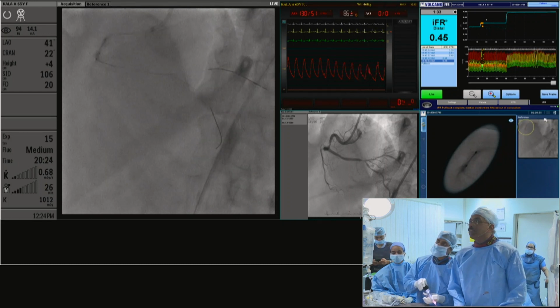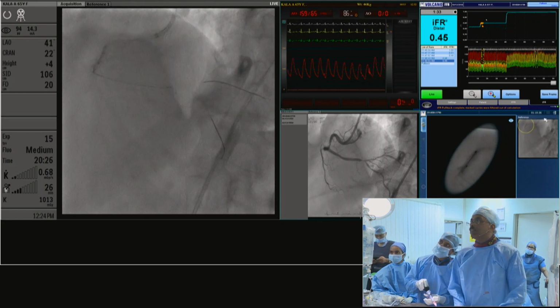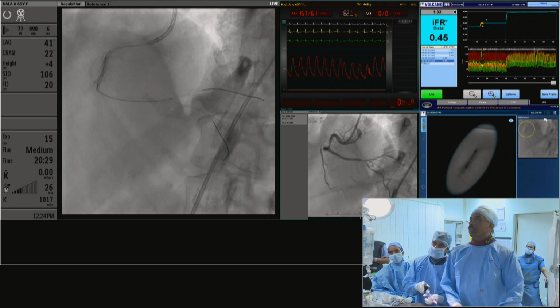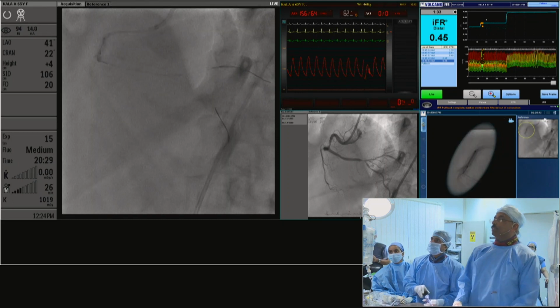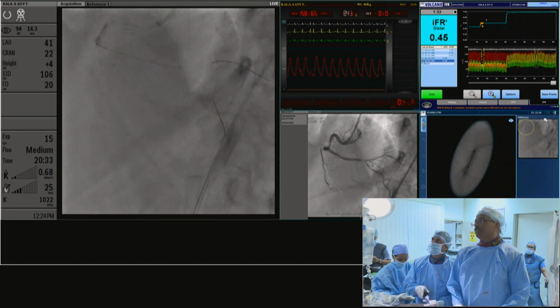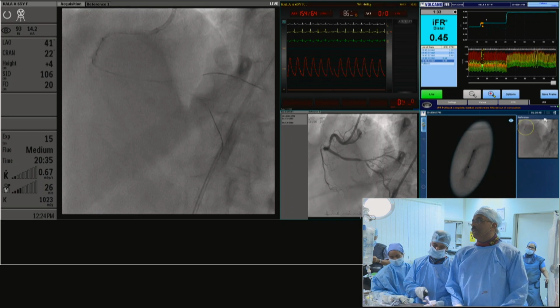So what are the other strategies around this? I have a question. Can I ask? Dr. Ajit, this buddy wire sitting there, will it not interfere with the angiosculpt cutting the edges? Because one of the sides, the guide wire will come between your cutting edge and the... Not usually. Yeah, I agree, but I hope not.